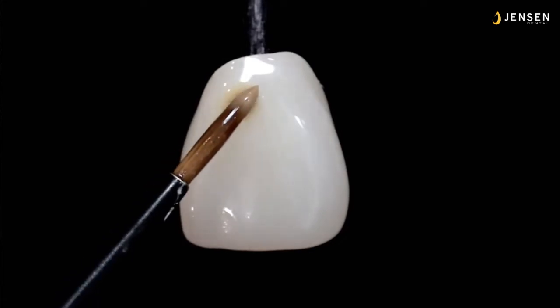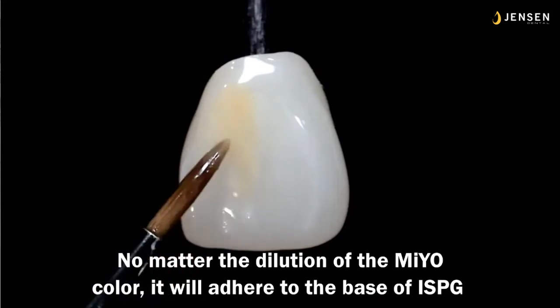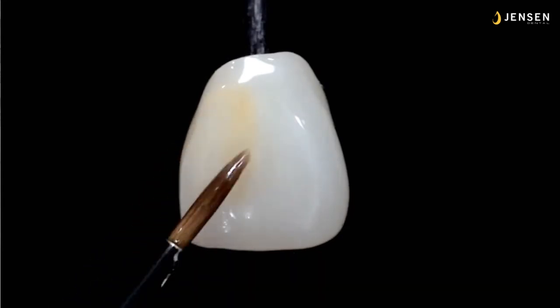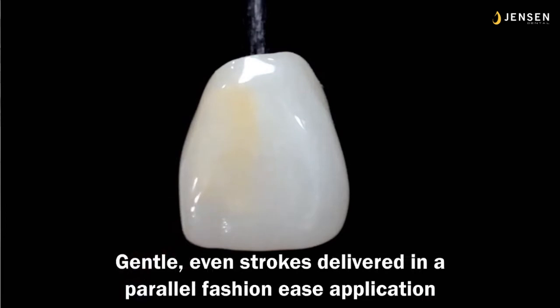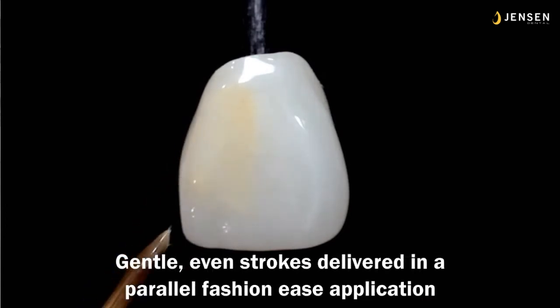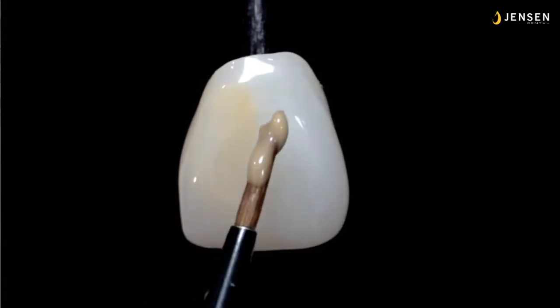I have some thinned down shade A. Now, notice the brush doesn't bend. It's very parallel, but no matter the dilution of the MiYO color, it will adhere to the base of Insync paste glaze. So you see, I'm not pushing the brush through the paste glaze. I'm just letting the color touch the paste glaze. Gentle, even strokes delivered in a parallel fashion facilitate the application.